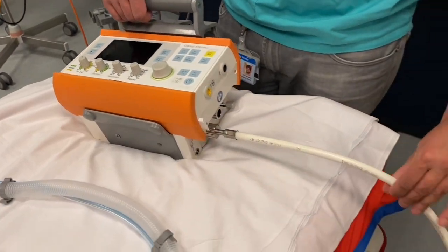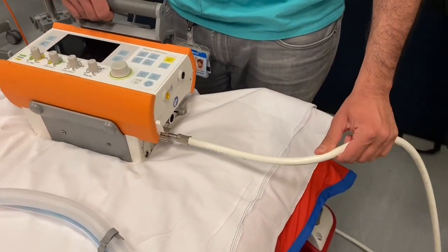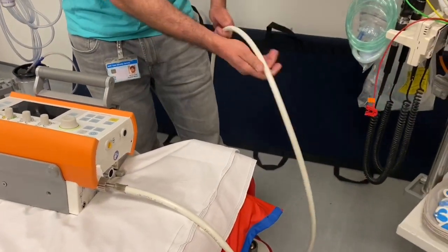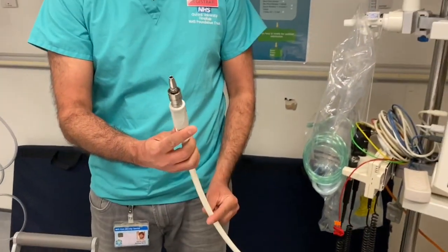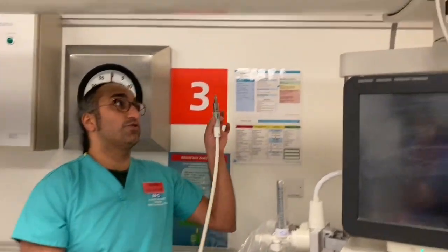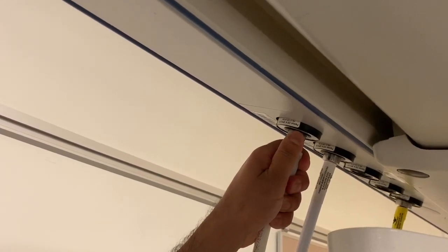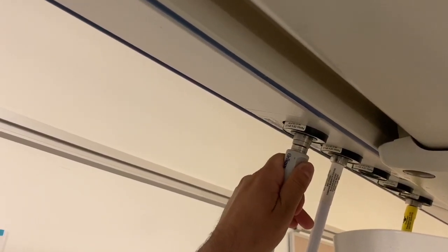First thing we need to do is to make sure that we have an oxygen supply via the Schrader valve. This is going to go to the supply in the wall. You want to make sure that as you turn you hear the click, then give it a very gentle tug to make sure that it is secure.